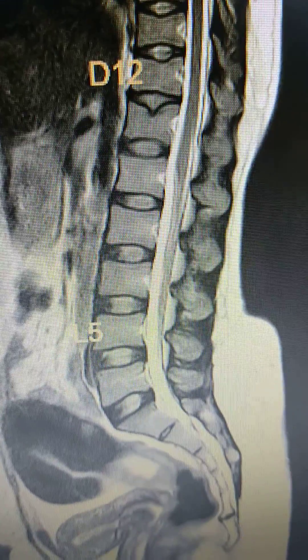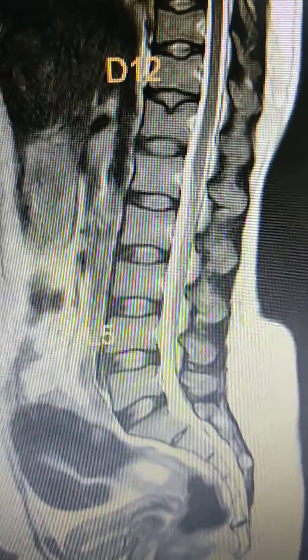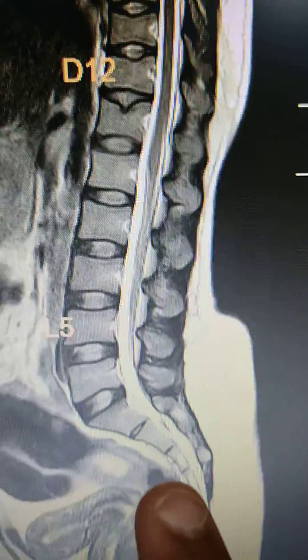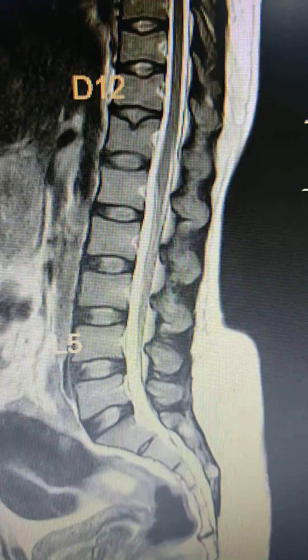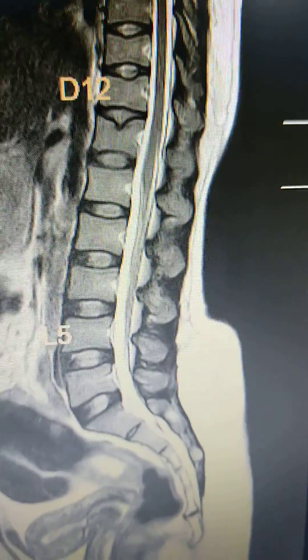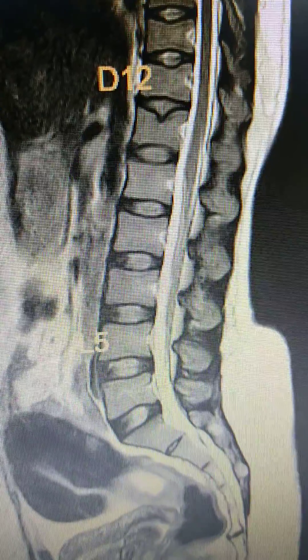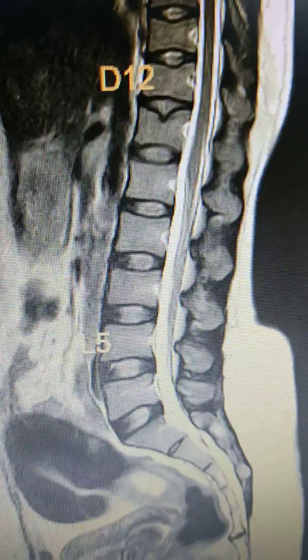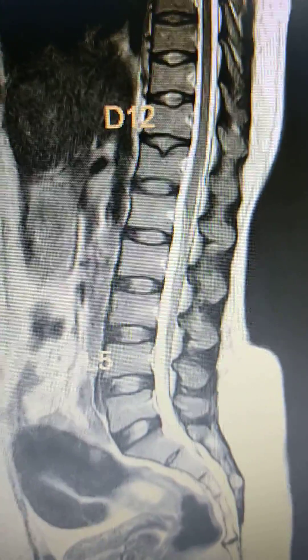Friends, by seeing the film we usually think this is the S1, but here there is a lumbarization of the sacral vertebra. I will show you how.